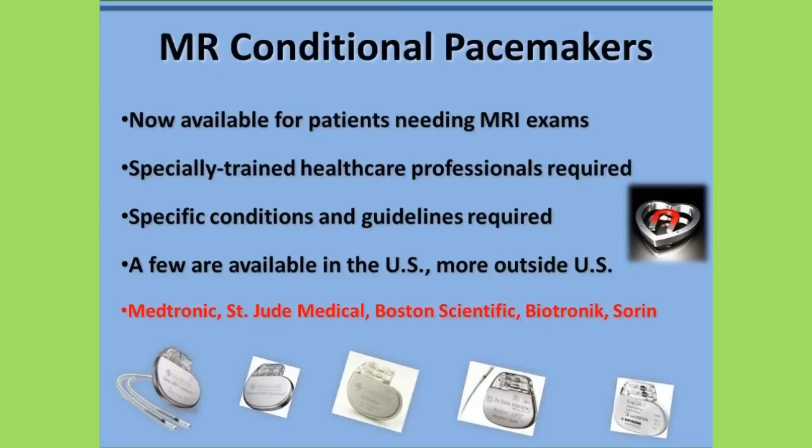Because of recent advances in cardiac device technology, along with a better understanding of MRI issues that impact these active implants, several MR conditional cardiac devices are now available for patients from various manufacturers, including Medtronic, St. Jude Medical, Boston Scientific, Biotronik, and Sorin.